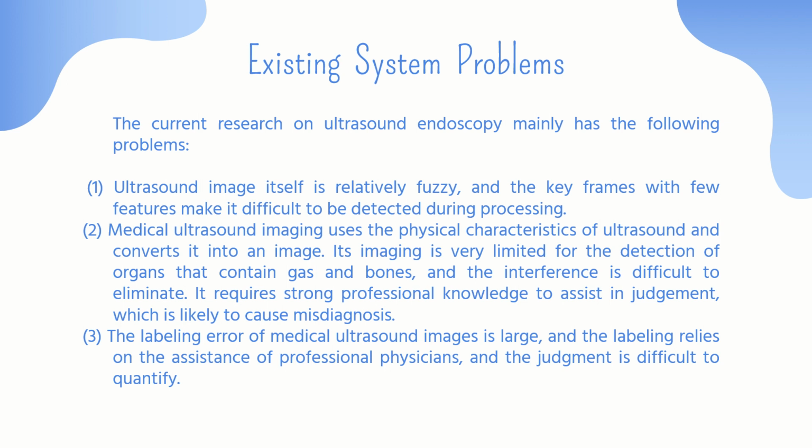And labeling errors in medical ultrasound images is also very important because it is dependent on the expertise of professional physicians, and the judgment is challenging to quantify.